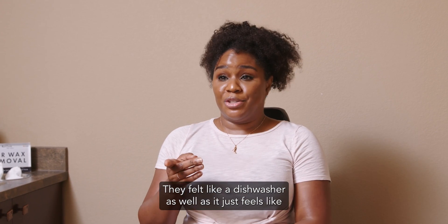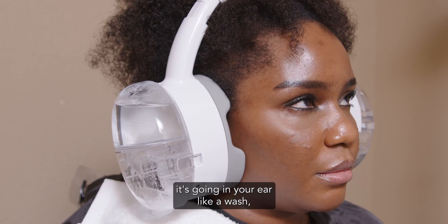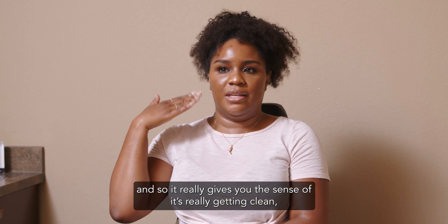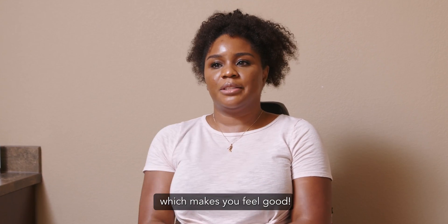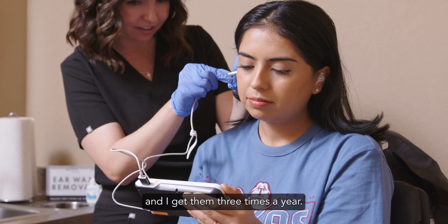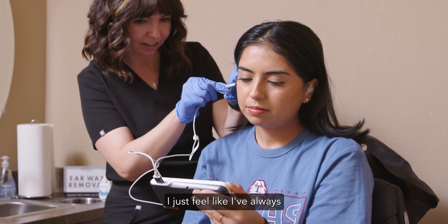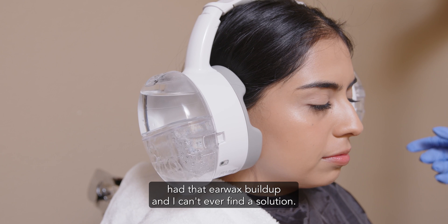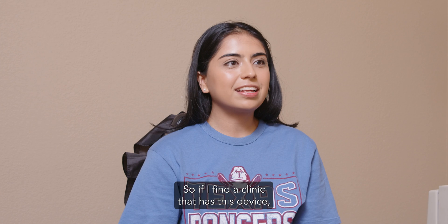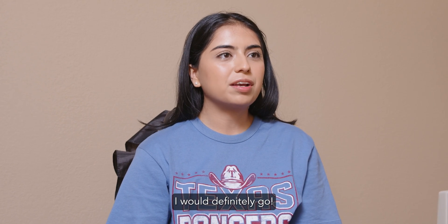It felt like a dishwasher. It just feels like it's going in your ear like a washer and it really gives you the sense that it's really getting clean, which makes you feel good. I get frequent buildup, especially with seasonal allergies, and I get them three times a year. I've always had that earwax buildup and I can't ever find a solution. So if I find a clinic that has this device, I would definitely go.